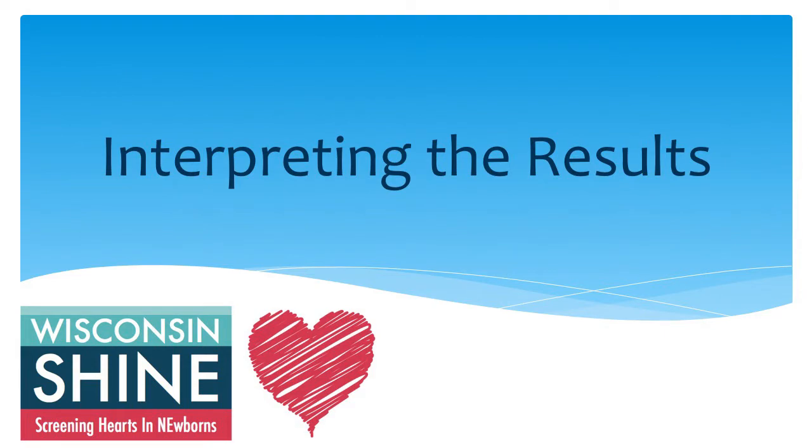Now you're ready to interpret the results. One of the key things I like to remember when interpreting the results is the idea of 2 sites, 3 strikes. 2 sites refers to the 2 sites that we got the measurements from, the right hand and either foot. The 3 strikes refers to the fact that the baby has 3 chances to pass the screen.